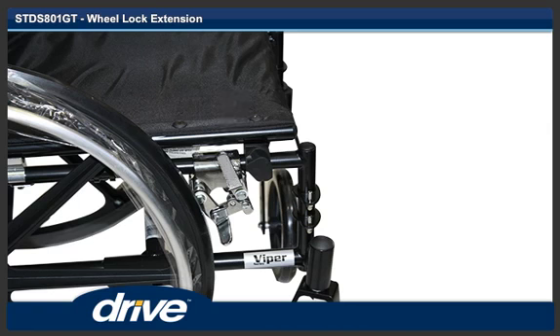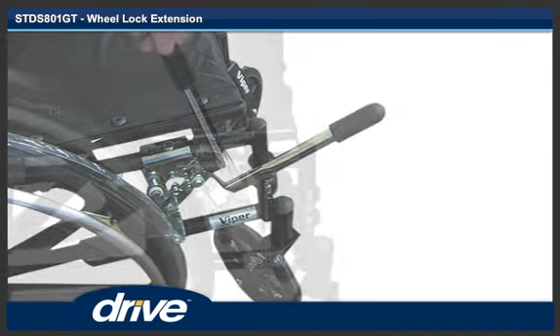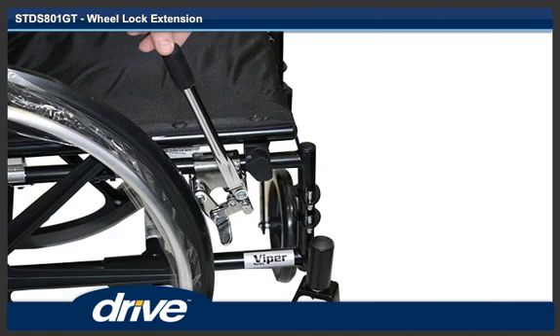Step 3. Slide the wheel lock extension over the wheel lock handle. Step 4. Push the extension forward to engage the wheel lock. Step 5. To release the wheel lock, pull back the wheel lock.